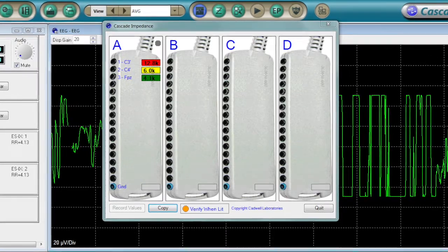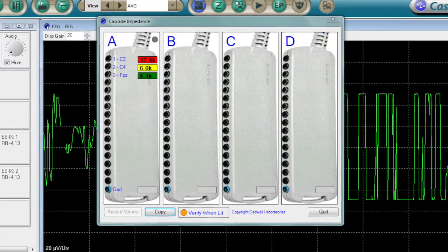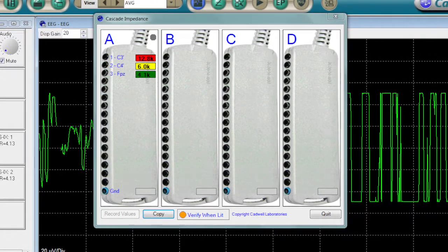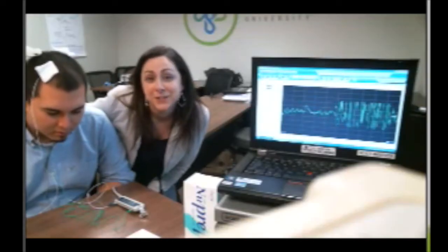If your electrodes are just above five kilo-ohms in impedance, they show as yellow. And if they are far above five kilo-ohms in impedance, they appear red. And here we have our patient and our EEG.